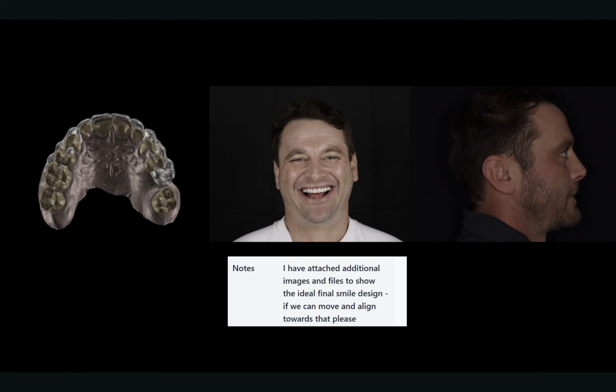And it gives you the ability to test, what is this going to look like? Get the patient excited. And not to mention, having that final destination means that from an orthodontic perspective, for example, in this case, I need to do treatment for him. So I was able to add the mock-up, the technical mock-up, which shows where we want the final teeth and restorations to be.